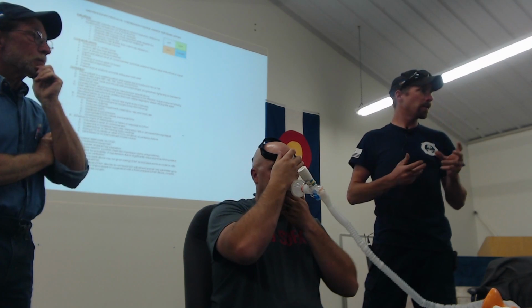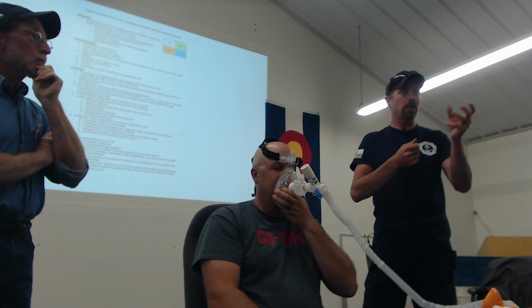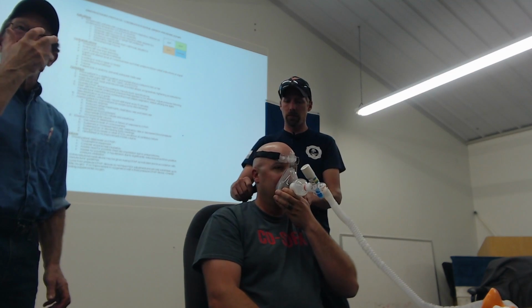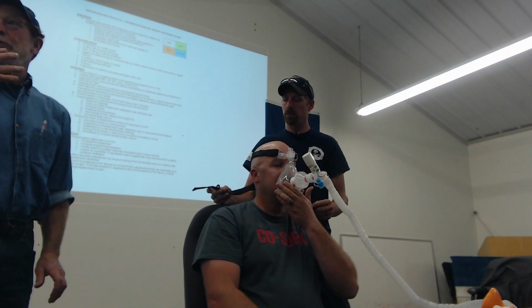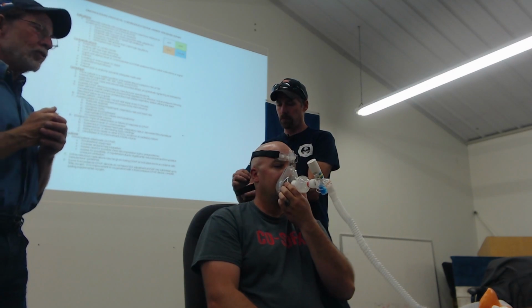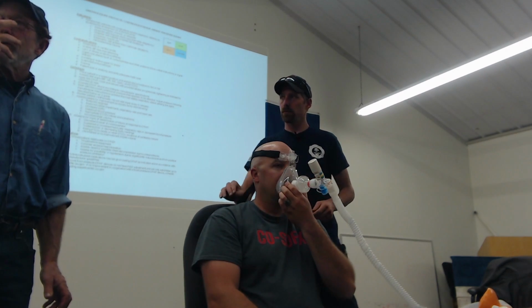A non-rebreather mask, same thing. If the patient can tolerate, man, just hand it to them. Let them put it on themselves. Tell the patient it's okay. Take it off, put it back on until you get used to it. It may take a second, and that won't hurt. But encouraging and coaching, pretty soon, within just seconds, generally, we'll find out. Okay, it's really not so bad.